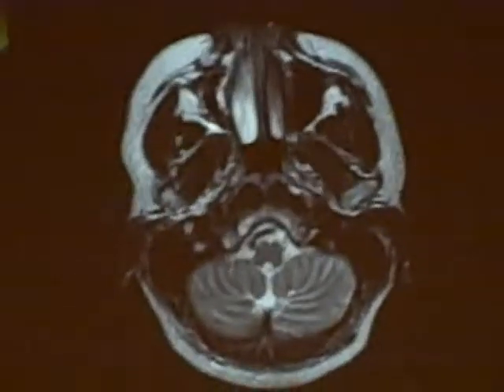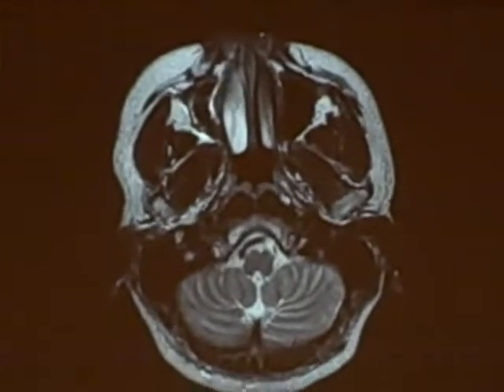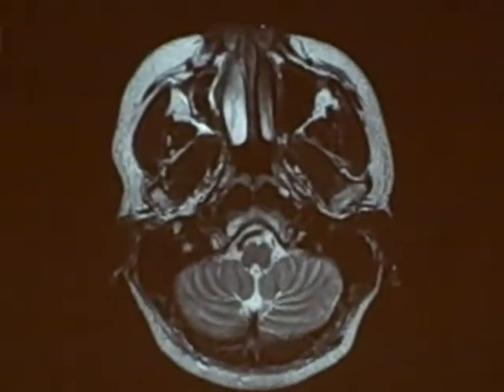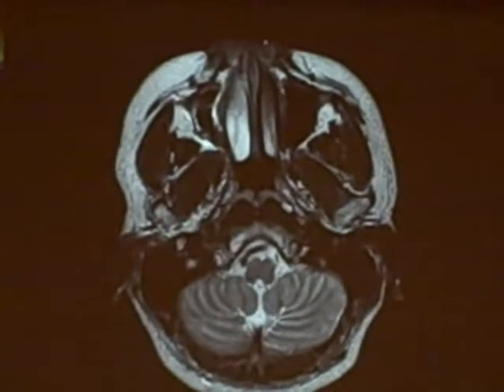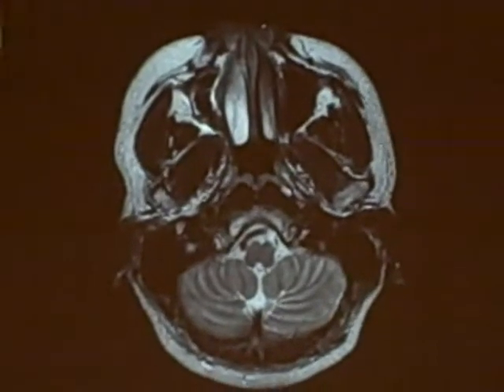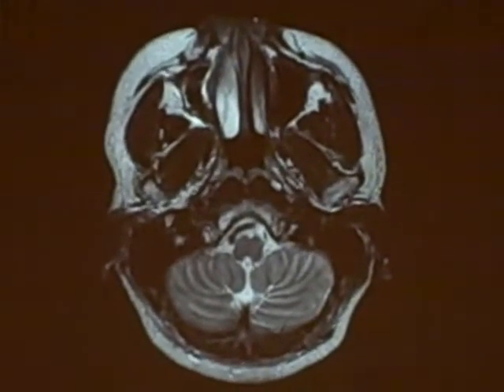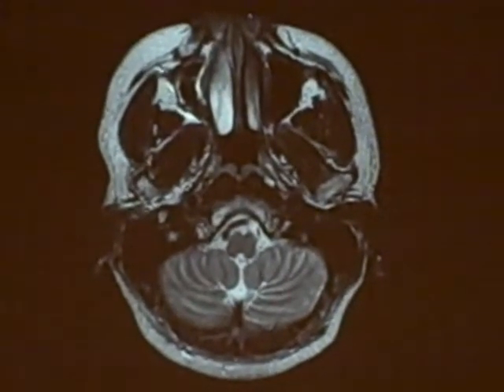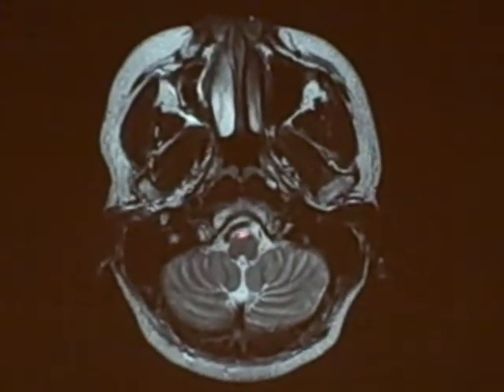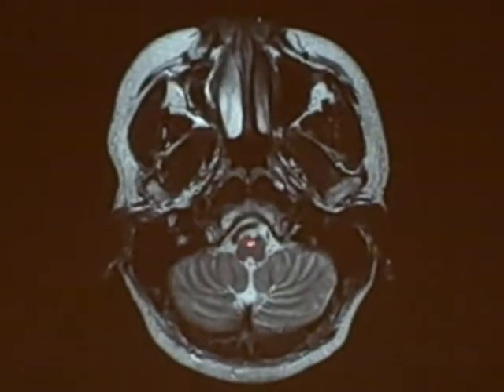Back here, the cerebellum and the medulla. MRIs look very well at soft tissue. We have a nice look here at the cerebellum and the medulla.